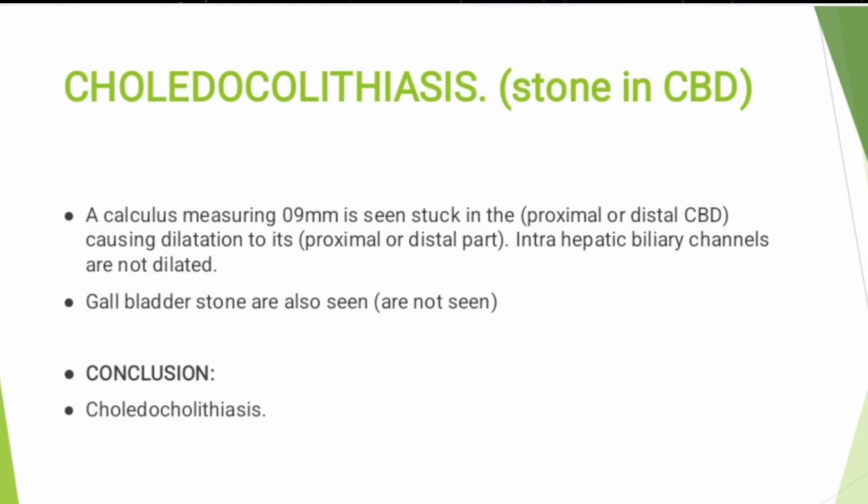You mention the location, causing dilatation of its proximal or distal part. Intrahepatic biliary channels are not dilated. Gallbladder stones are also seen, or if it is not present, mention it is not seen, it might have slipped within the CBD. So that's why I conclude it as a choledocholithiasis.